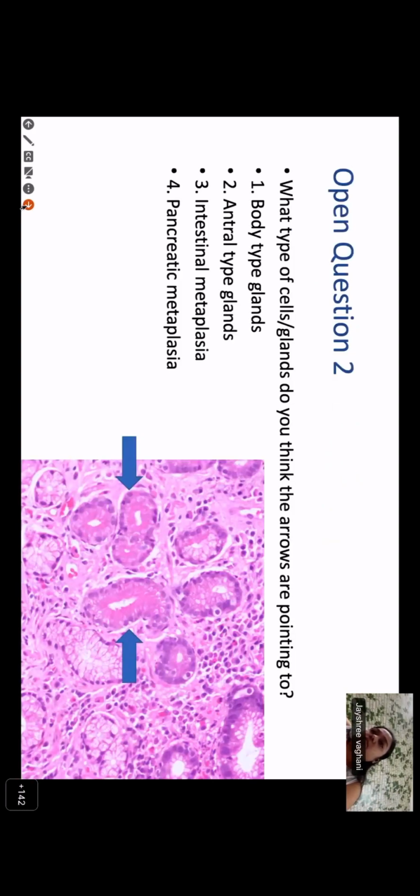Ma'am, what do you see? If there is a middle-aged patient and a biopsy from the antrum shows lymphocytic infiltration and some neutrophilic infiltration also, which shows active infection in chronic gastritis, and some mucin depletion and oxyntic cells also seen. Okay, so this is the next open question.